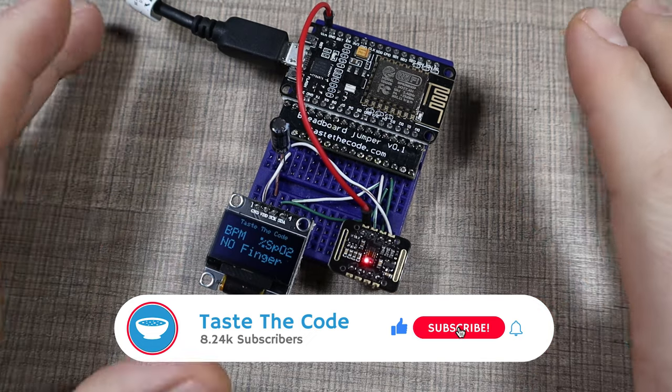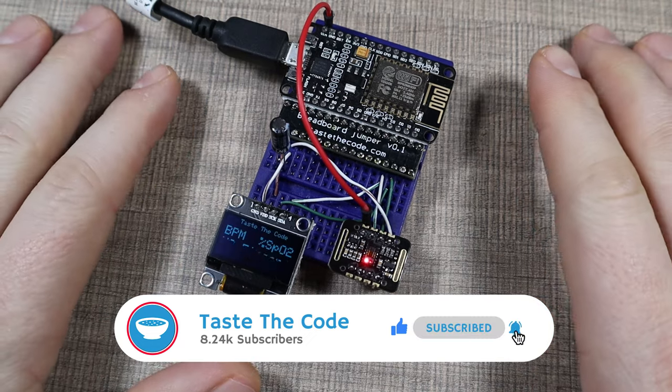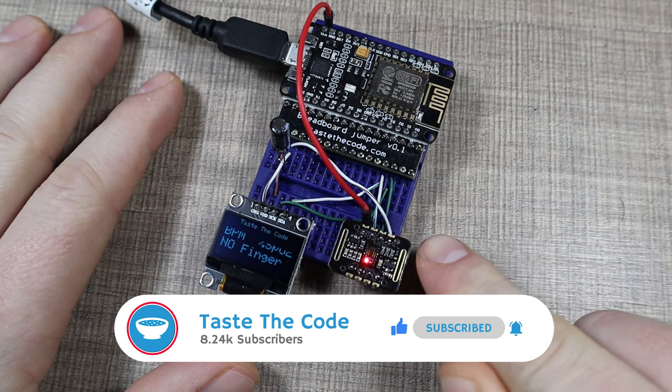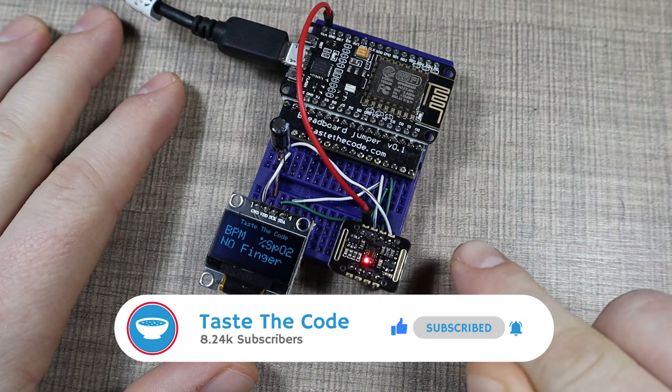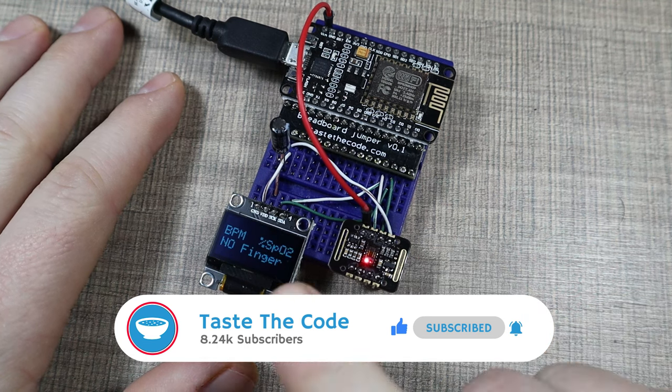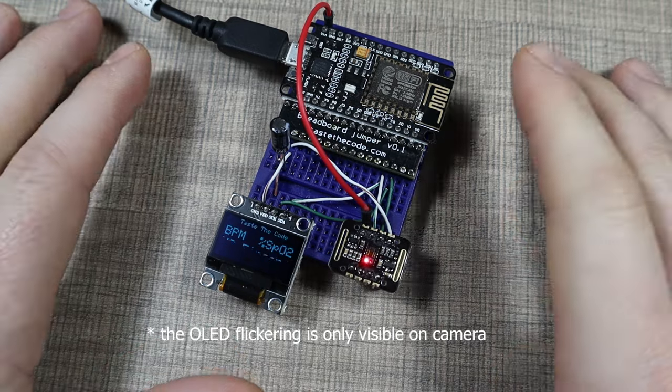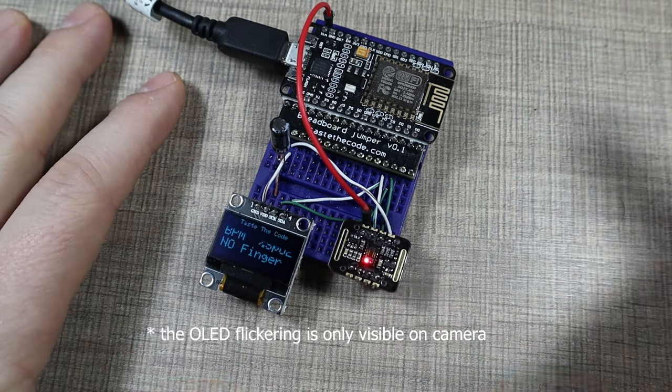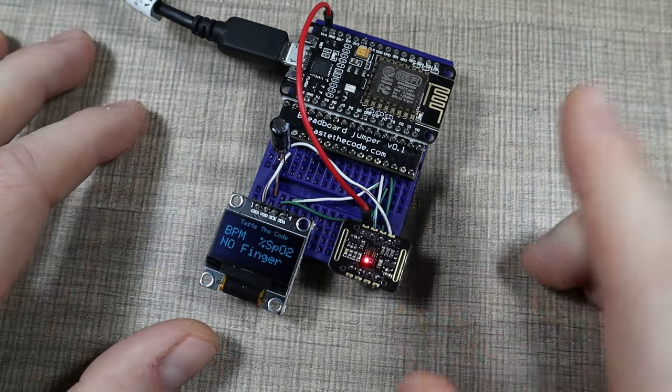Hi everyone and welcome back to the channel. Today we have a little project using the MAX30105 oximeter sensor and an OLED screen to make a pulse monitor and also a saturation monitor for our blood.